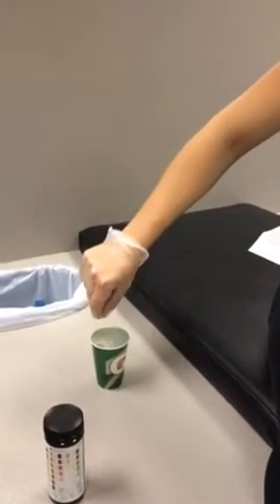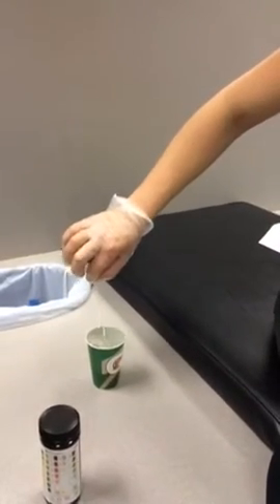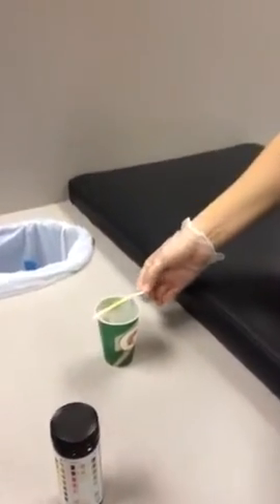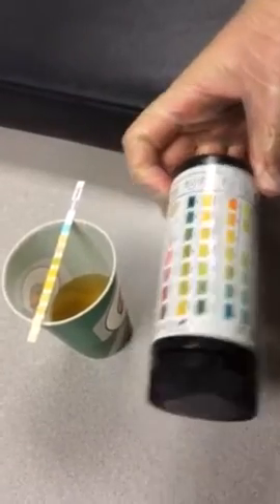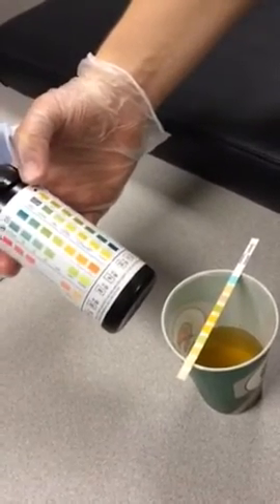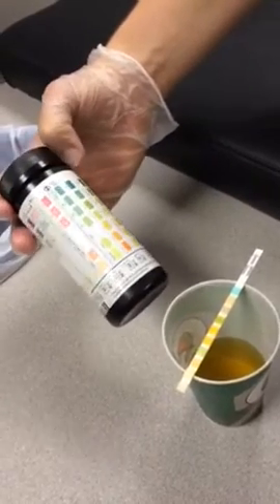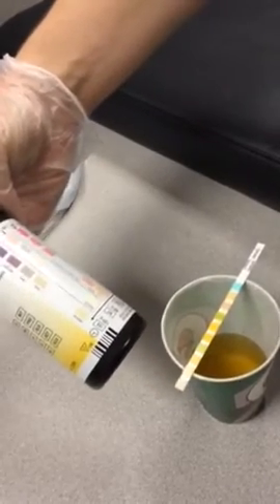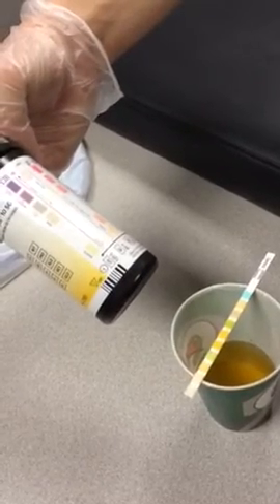After a minute has passed, lightly tap the urine strip against the edge of the container to make sure you're not getting urine on anything. Assess the colors as compared to the bottle. It's looking like they've got some non-hemolyzed blood. They do not have any infection, and there are no leukocytes. There is no discoloration or darkening on our test strip, so we can safely assume that the test worked. Thank you.